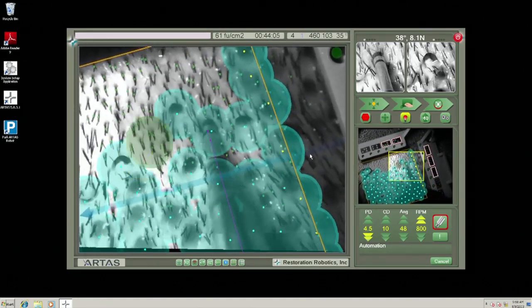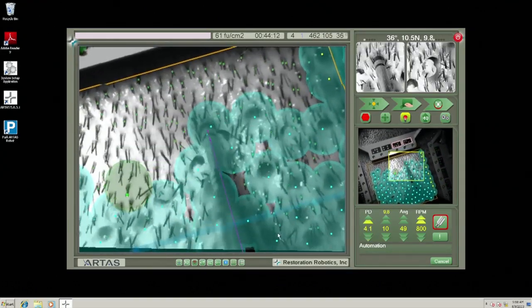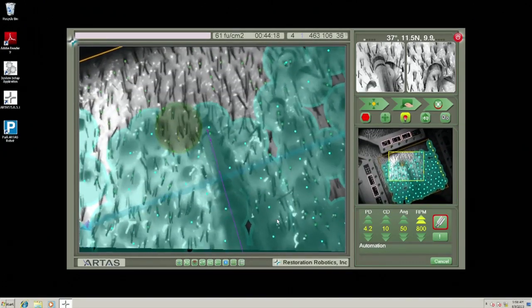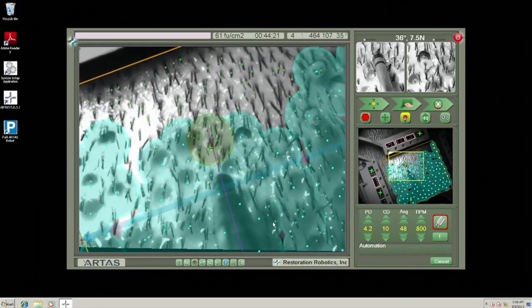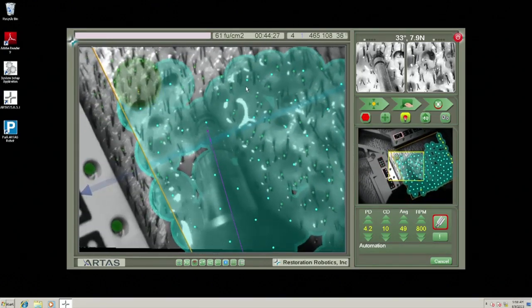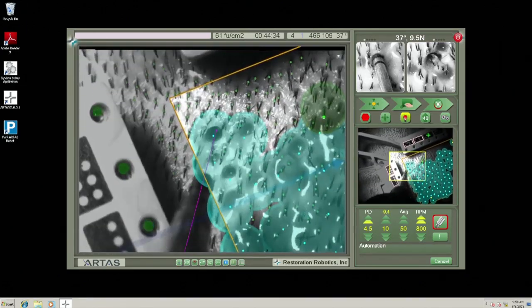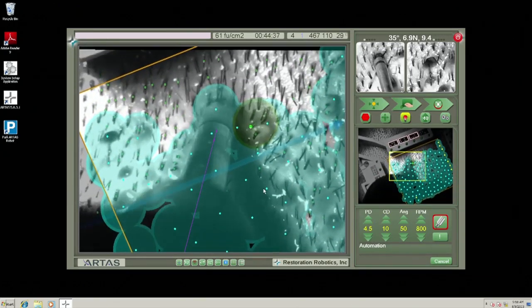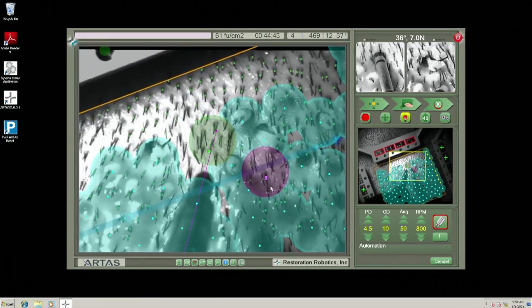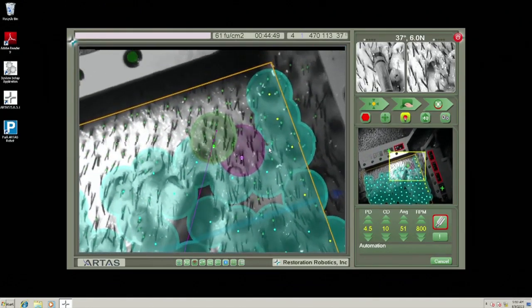When I look across the board, aside from this case, and take an average of different cases, if I know I'm going to do 1,000 or 1,200 harvest attempts, then it's going to be around 2 hours and 15 minutes in the robot in general. Now, I can speed that up substantially, probably to around an hour and 50 minutes. But we really have to modify our techniques and not necessarily flush between each grid, etc. So we can push the robot and make it go faster by eliminating some of the steps between each grid.